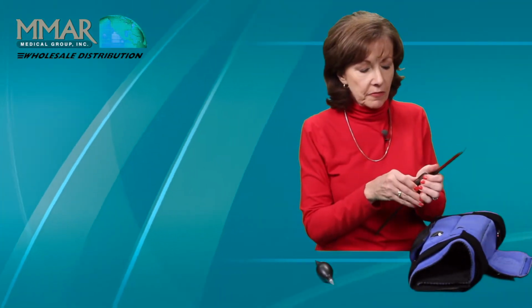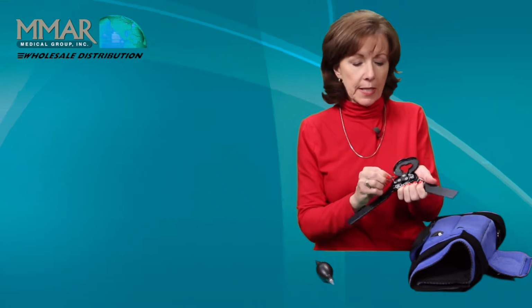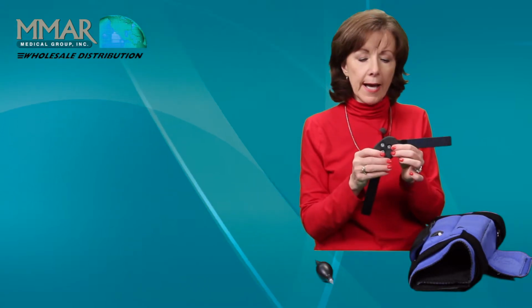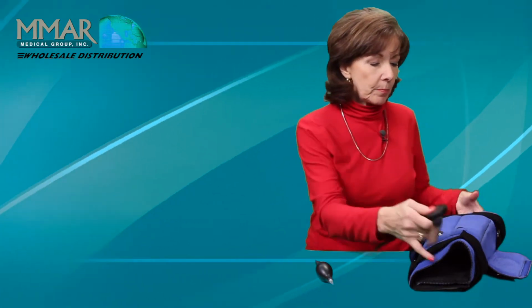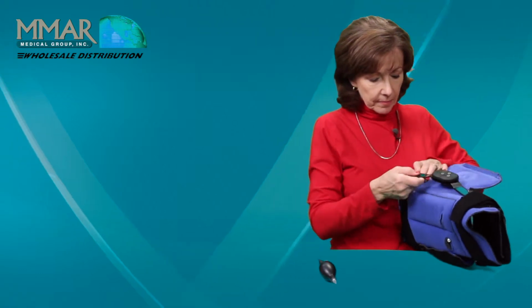These hinges are very simple to set at flexion and extension. You simply pop out the little pin and it goes back in. They're attached with little loops so they won't fall out, and you snap it into place. You bend the device and put them back in.